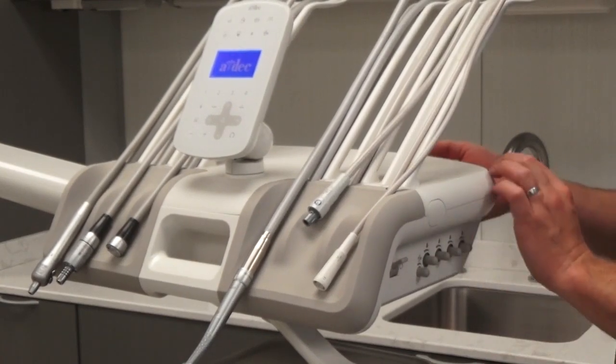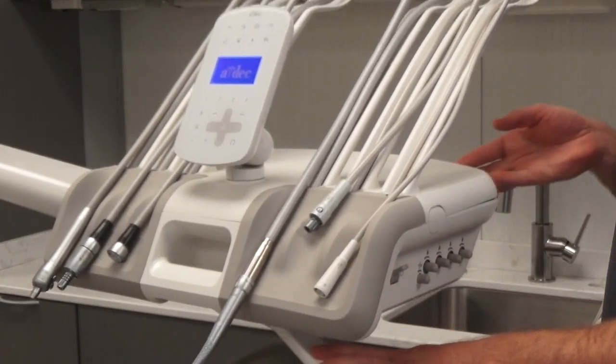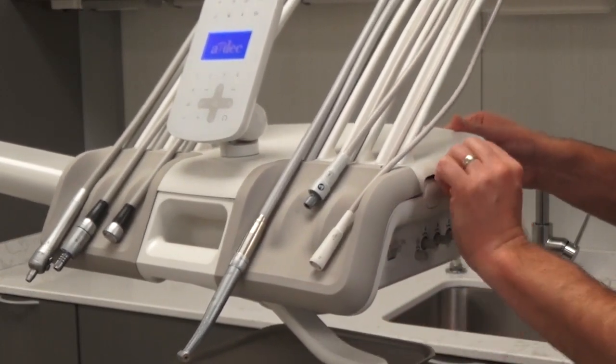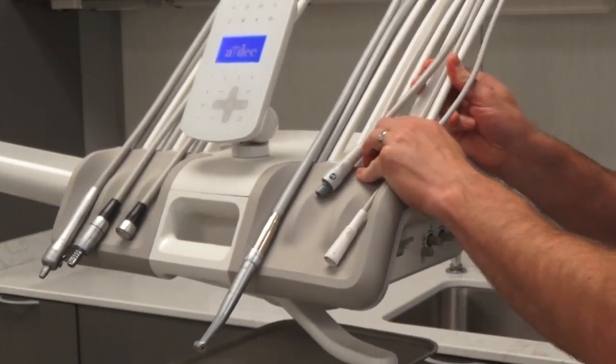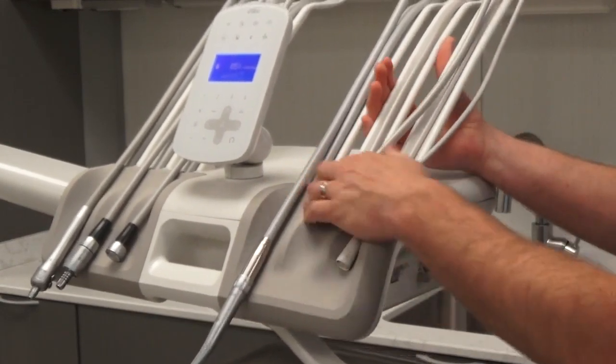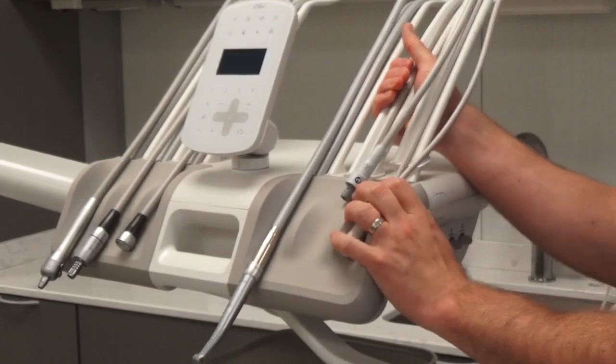The first thing you'll do is actually lift up on the back to open the cover of the delivery system, so you can create a gap right there. And once that's done, you'll also need to lift up on the whip arms, because those whip arms have little tabs that hold the instrument pad in place.